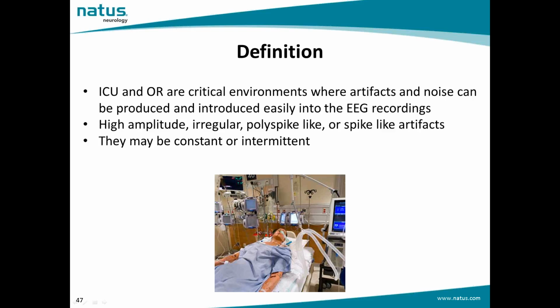Unfortunately, any device with an electric motor may produce high amplitude, irregular polyspike-like or spike-like artifacts. Typically, the artifact occurs with the motor's activity, and so it may be constant or intermittent. For instance, the infusion pumps generally represent a typical source of artifacts in ICU.